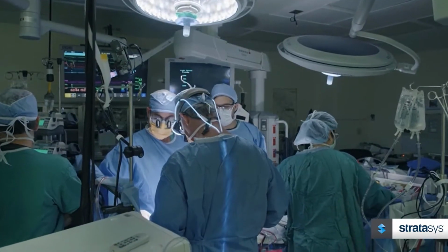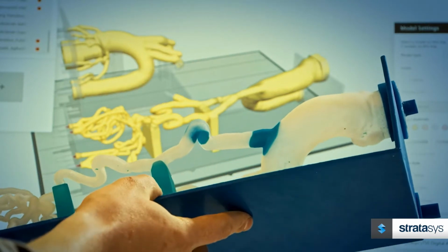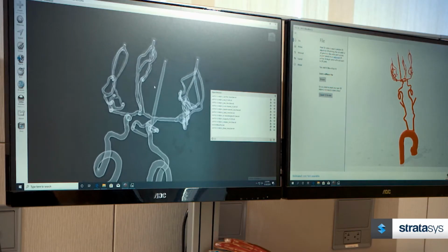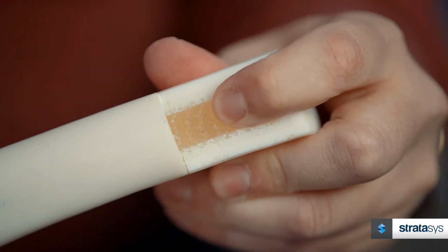test their innovations. There are limitations and ethical concerns with acquiring animal or cadaver medical models, but Polyjet 3D printing offers anatomically accurate, biomechanically realistic, highly functional models created directly from human anatomy scans. There are a range of tissue properties available from bone to soft tissue and an integration of anatomical microstructure.